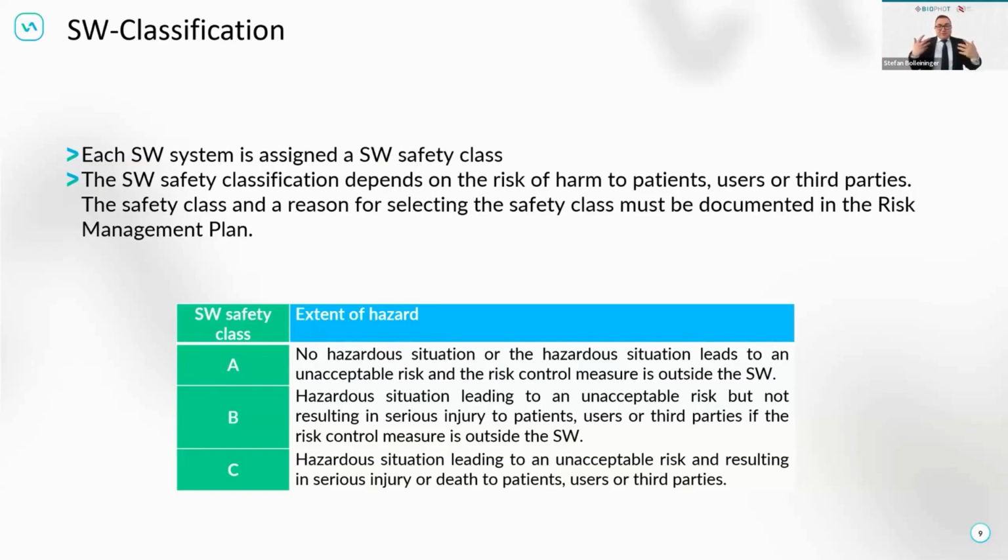That's why it is a process standard. It's a standard which gives you the opportunities to go the full way during the complete run and gives you all the information how to manage your development and ensuring you have the best possible reasoning between efficiency and safety. And the more you need, Class C for software safety classification, the more you need to document.